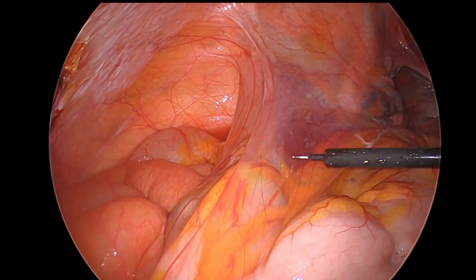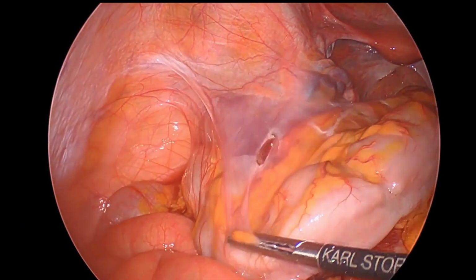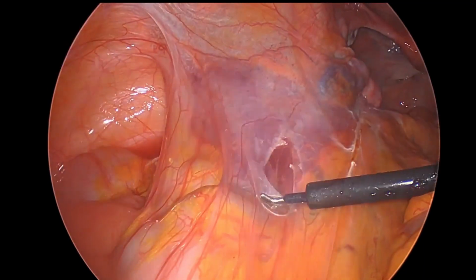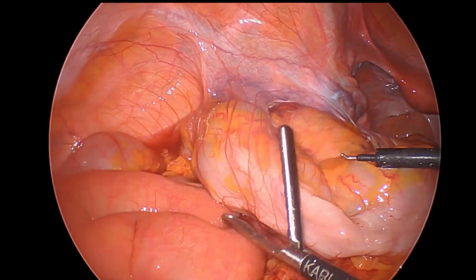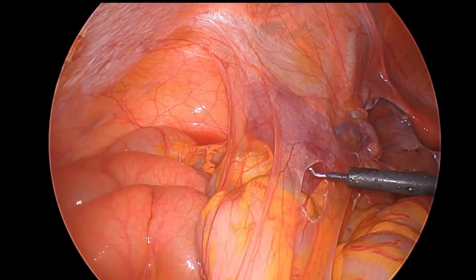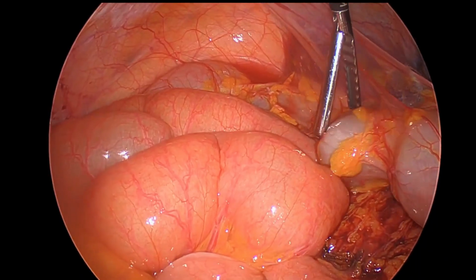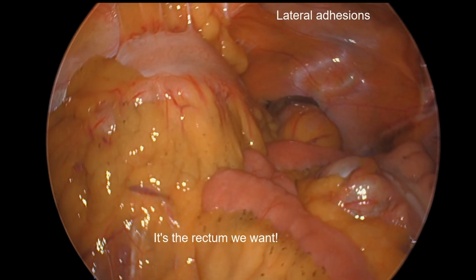I should mention this video is a video of a fairly thin patient in which the patient already had two synchronous lesions, a right colon cancer as well as a rectal cancer, and so we've already done the right colon dissection, and now we're doing the low anterior. And so you can see this nice purple hue here of the tissues that indicates the dissection that we've done from below. We're going to break into that eventually and get into our medial dissection.